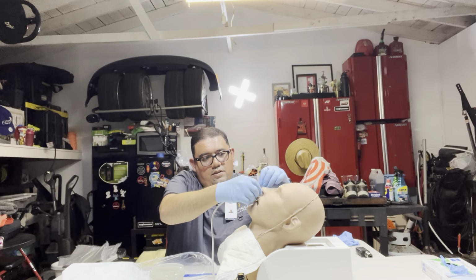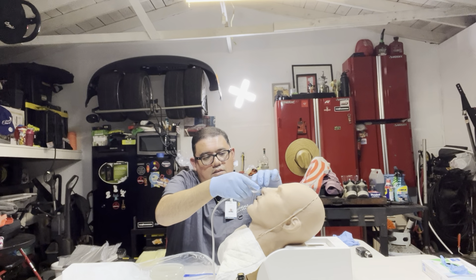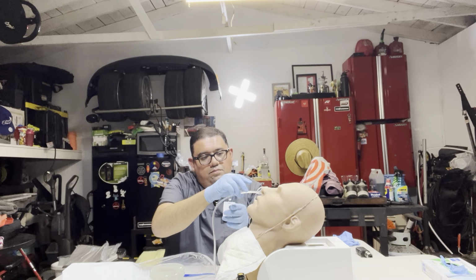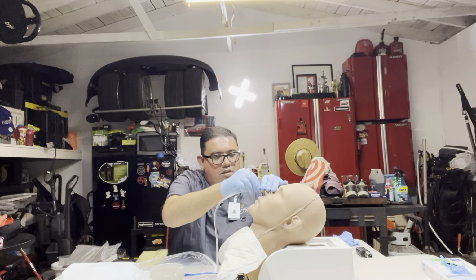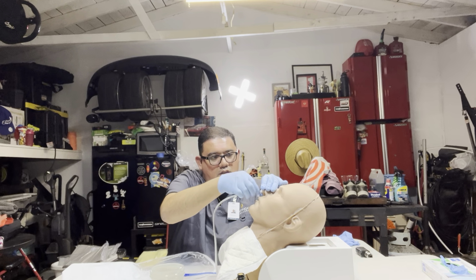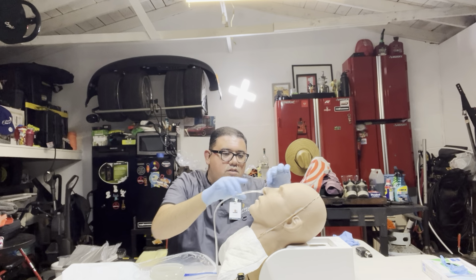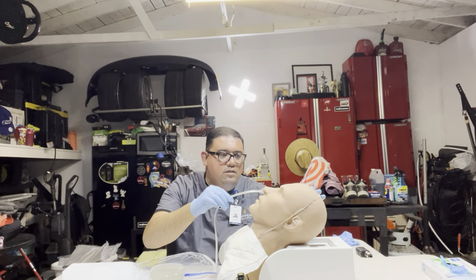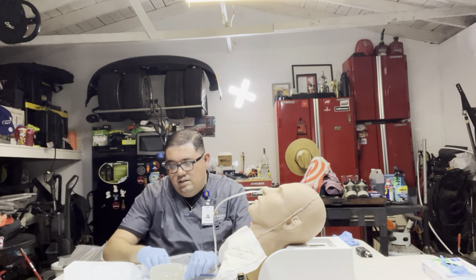Mr. James, you doing okay? Perfect. Just talking to the patient while you're doing this helps bring down the anxiety of the patient as well. Perfect. All right, Mr. James, NG tube's in place, inserted, and it is anchored to your nose, okay?